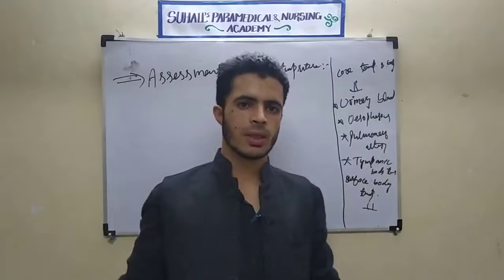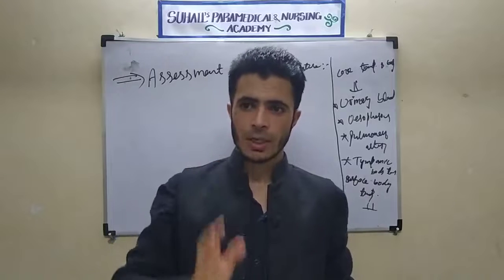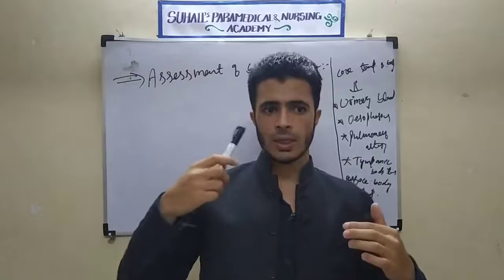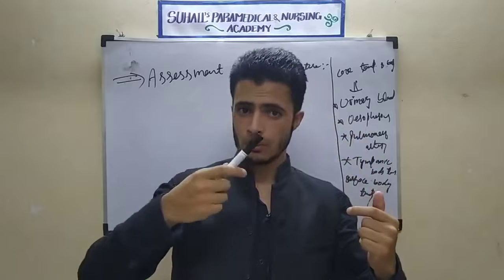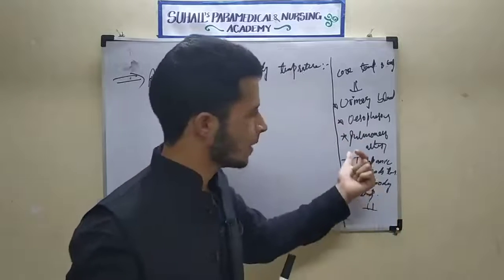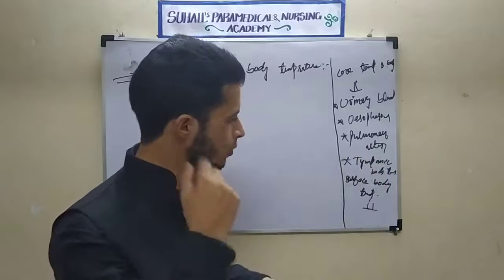thermometer, this tympanic thermometer. When we keep it there, remember, the inner ear is close to the hypothalamus and the brainstem.